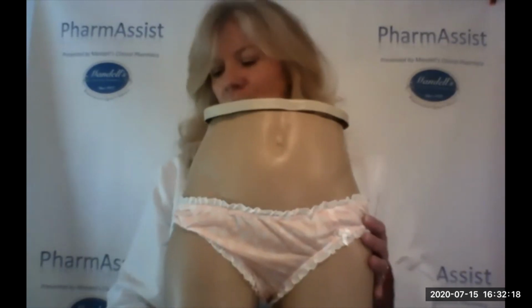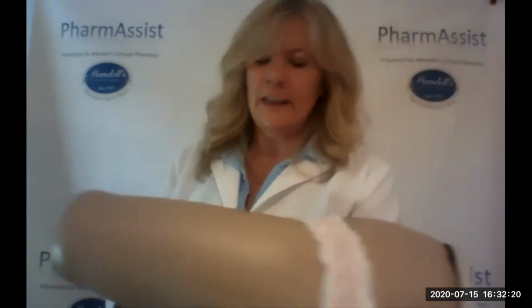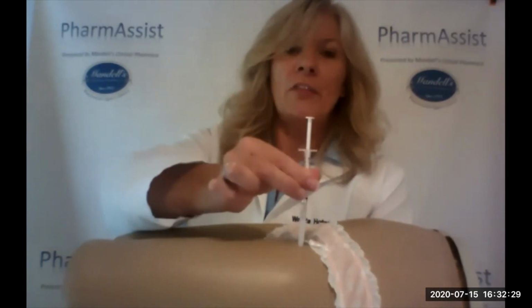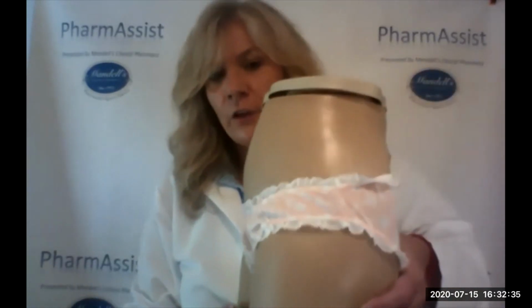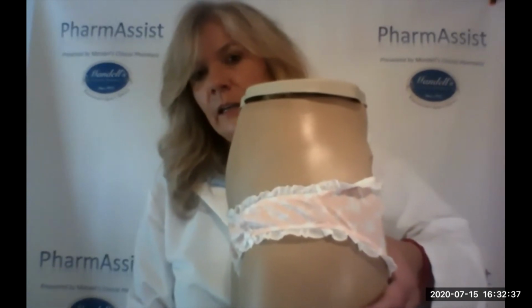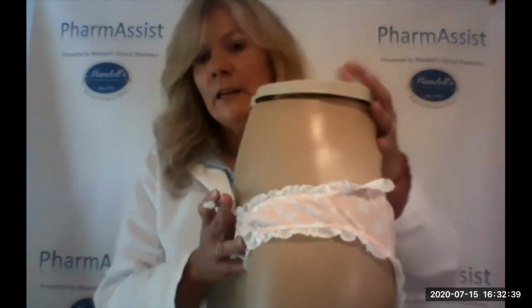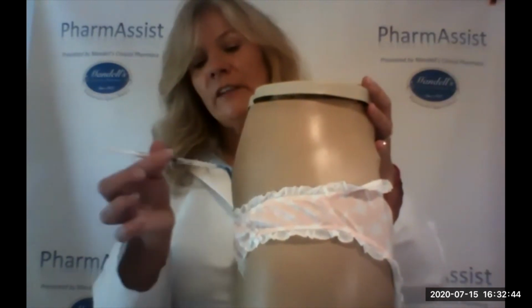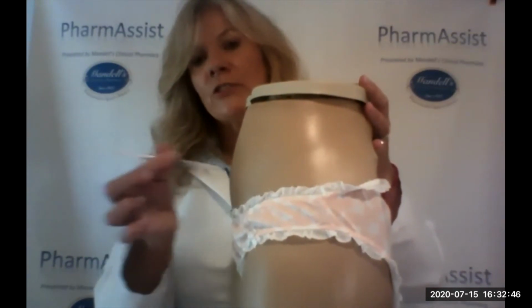If I were to give this person her injection and she were laying down, I would have her lay on her back, and this injection would go in at a 90-degree angle on the belly, would be a 90-degree angle on the top of the thigh, and a 90-degree angle into her side thigh. Because you can also self-inject, though, if she's standing or sitting, this would be the position of her body. So if she's standing or sitting and self-injecting, the angle of the needle is going to just go straight in.